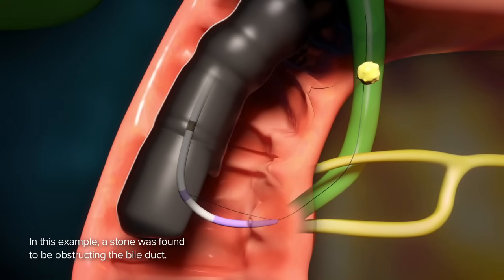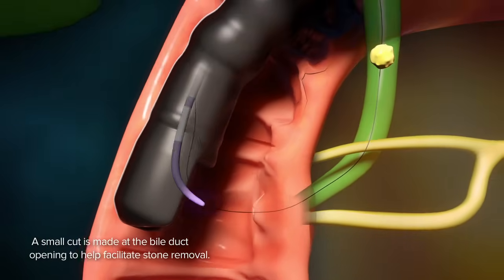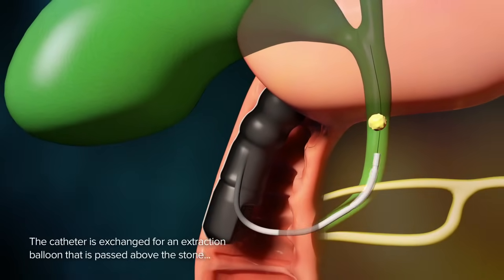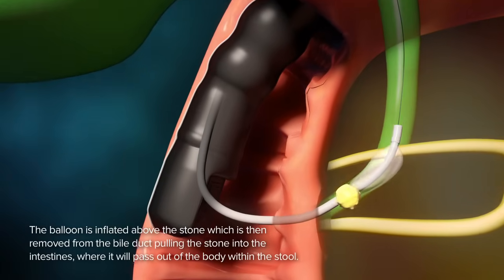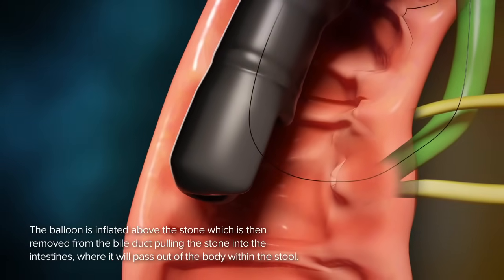In this example, a stone was found to be obstructing the bile duct. A small cut is made at the bile duct opening to help facilitate stone removal. The catheter is exchanged for an extraction balloon that is passed above the stone. The balloon is inflated above the stone, which is then removed from the bile duct, pulling the stone into the intestines, where it will pass out of the body within the stool.